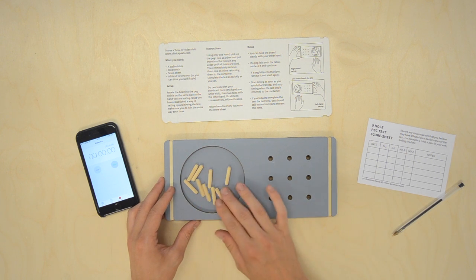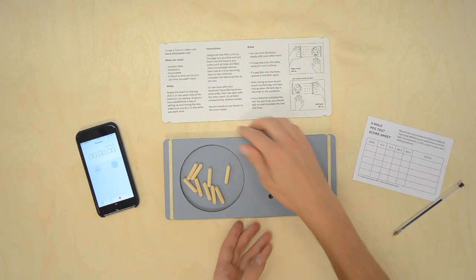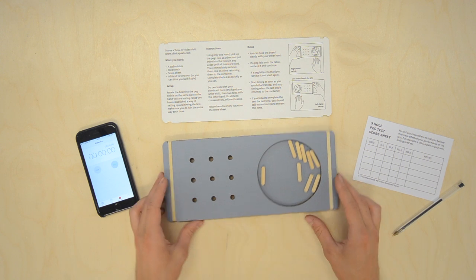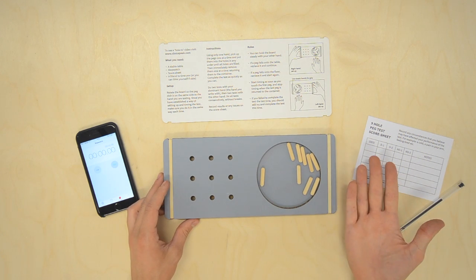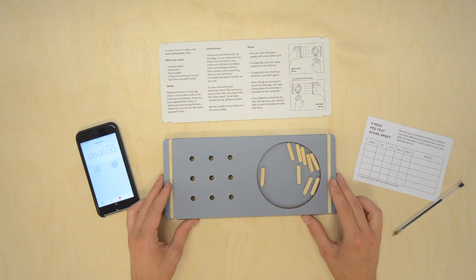Make sure you have 9 pegs in the dish. Rotate the board so the peg dish is on the same side as your dominant hand. This is the hand that you write with. You are now ready to start the test.